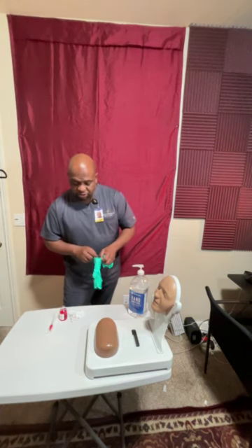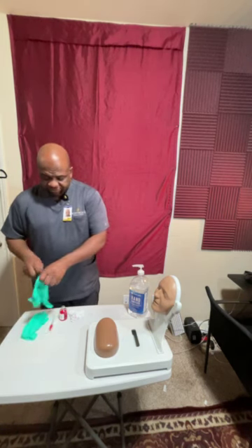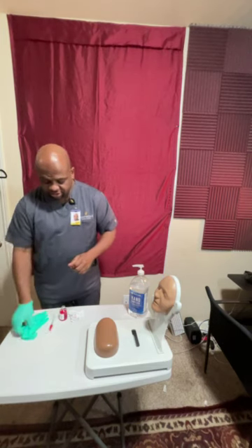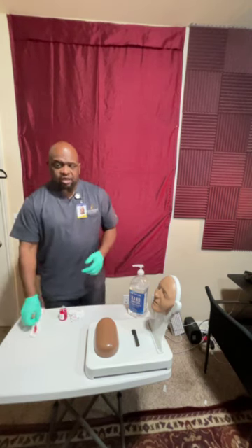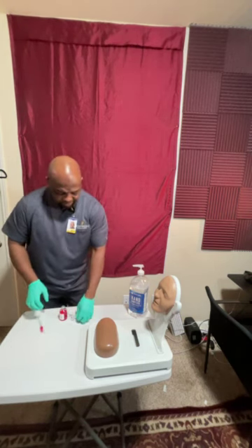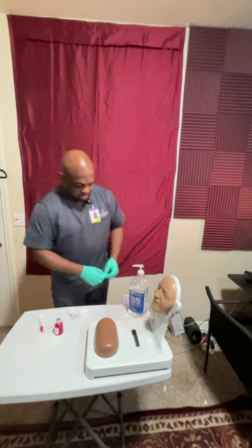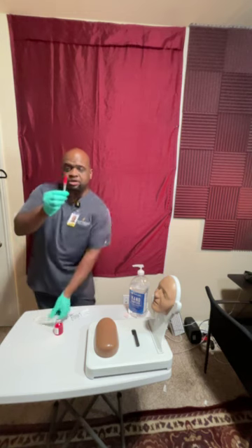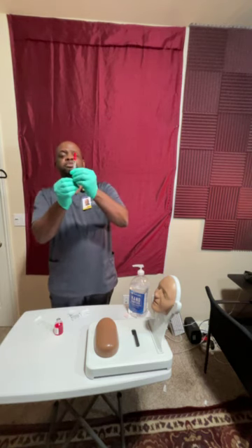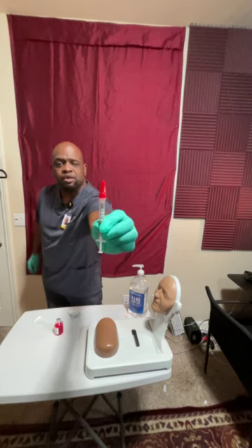So first things first, I am going to select the site that I'm going to be giving this injection, right? I'm sorry, let me put on my gloves first. Gloves on first. And what we're going to do is I'm going to wipe off the cap of the bottle with the alcohol wipe and let that air dry. Okay, let's get rid of that one there. And with the syringe, with the cap still on, I'm going to draw up 0.1 mLs of air into the syringe, just 0.1 mLs of air, right? Got that there, that's 0.1 mLs of air.